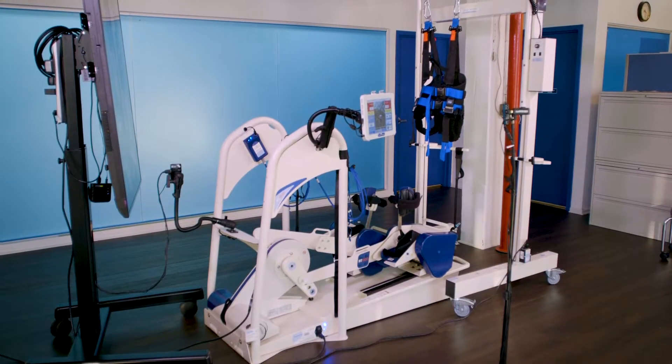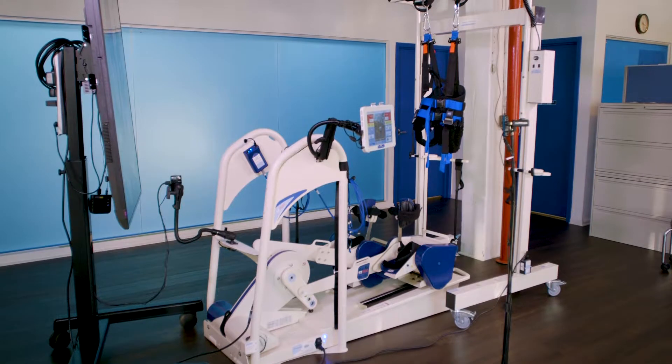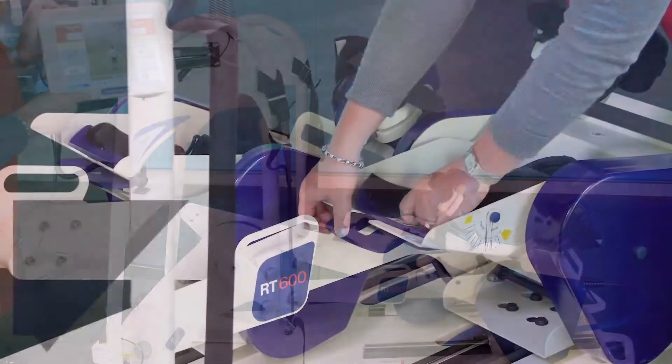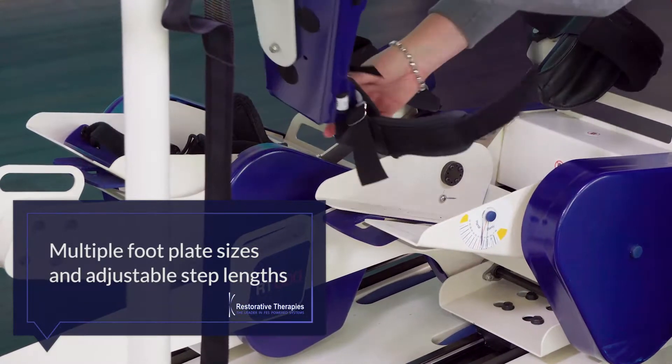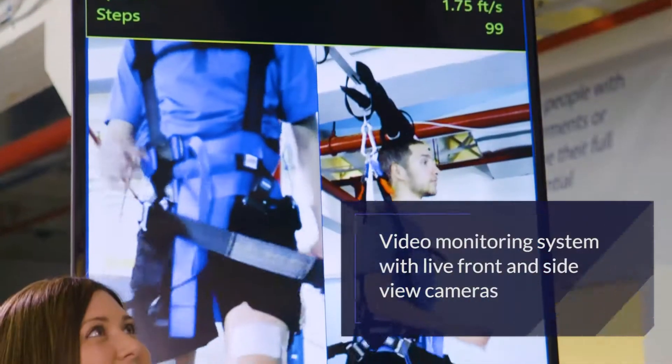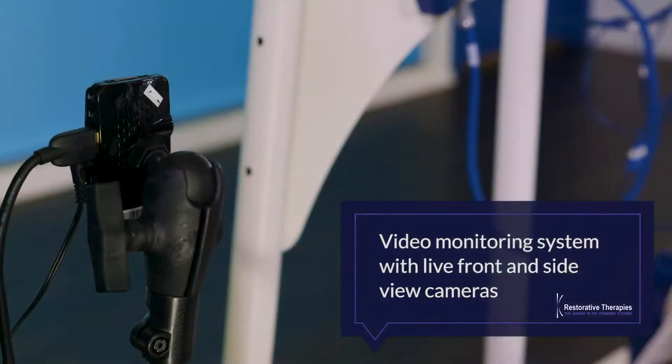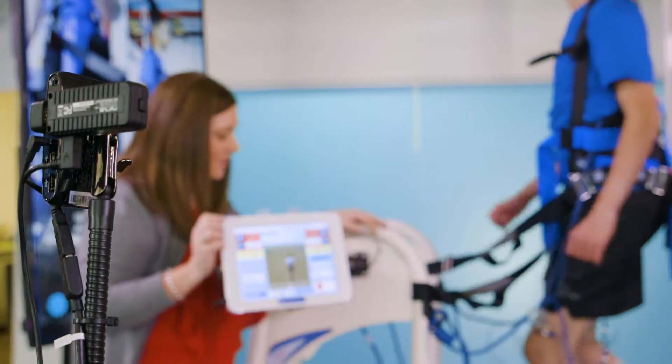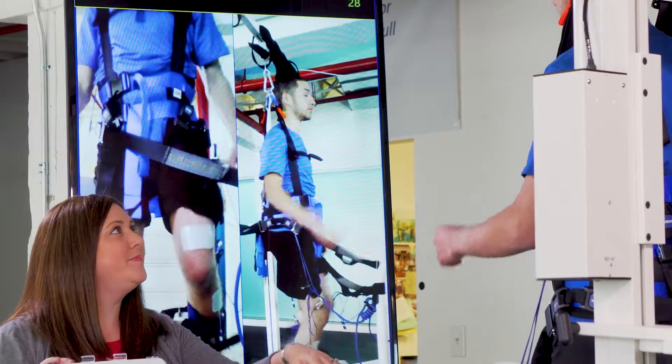The RT600 has many unique features which contribute to its important clinical benefits. Some of those features include multiple footplate sizes and adjustable step lengths, pediatric adaptations, and a video monitoring system with live front and side view cameras that assist in maintaining a heads-up stepping position and enhance patient monitoring by the clinician.